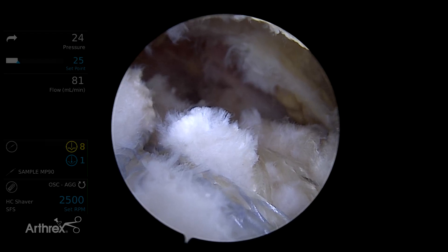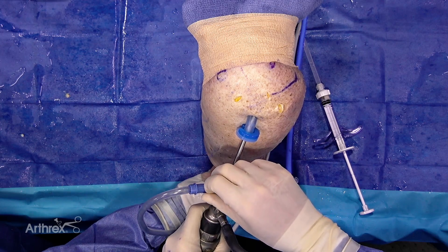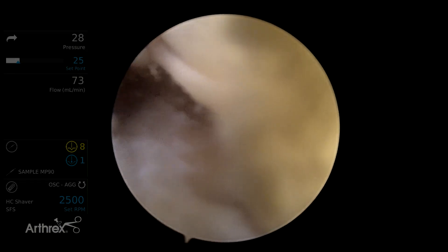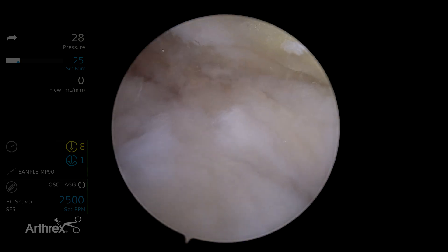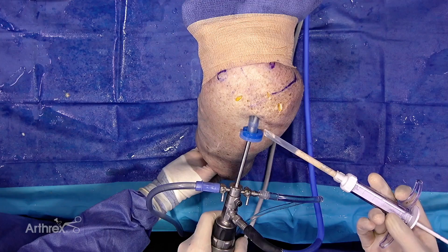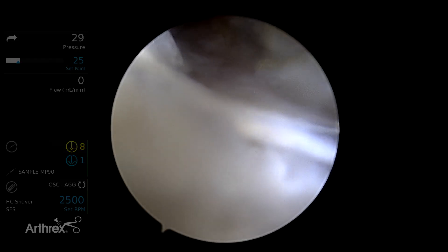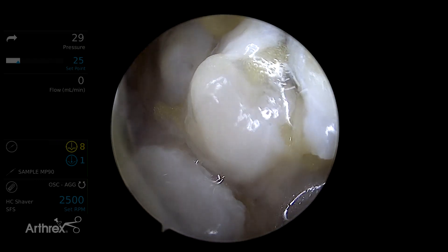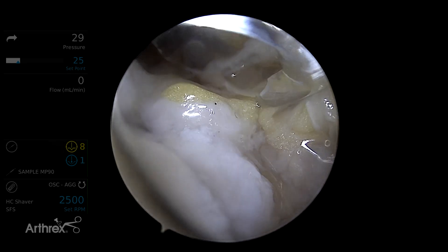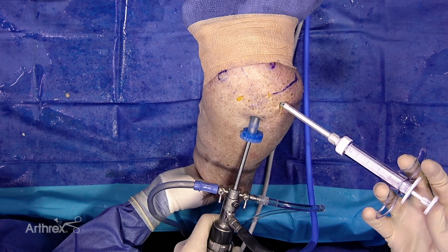We've completed our rotator cuff repair using a speed bridge construct. Now what we need to do is evacuate the fluid from our shoulder — we'll turn off our inflow and turn on our suction. Sometimes our tissue can cover up our repair, so we'll push in a little bit to get that tissue out of there. Now we can see our rotator cuff repair; we've taken the fluid out of the subacromial space. We've got our BioExpress graft delivery device. Now that we've got a dry subacromial space, I'm going to insert this through our posterolateral portal and use our second plunger to deliver this right into the subacromial bursa space.